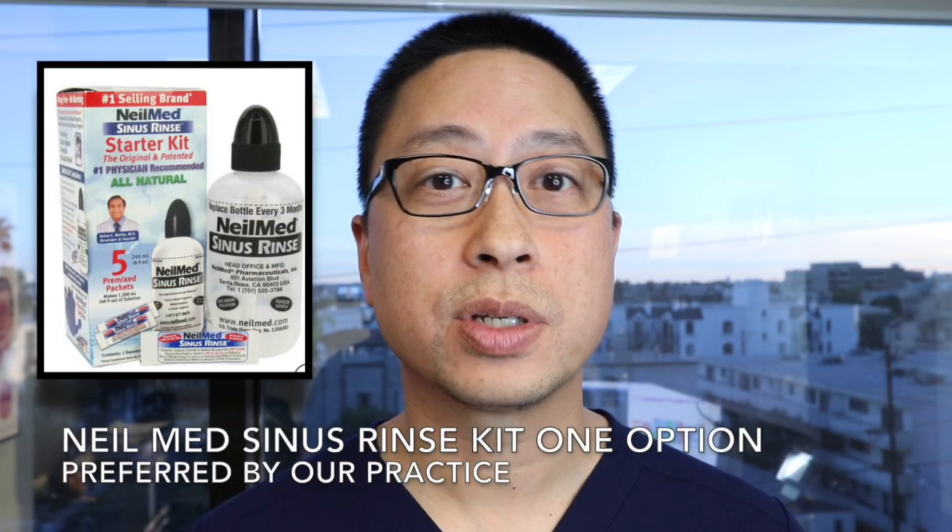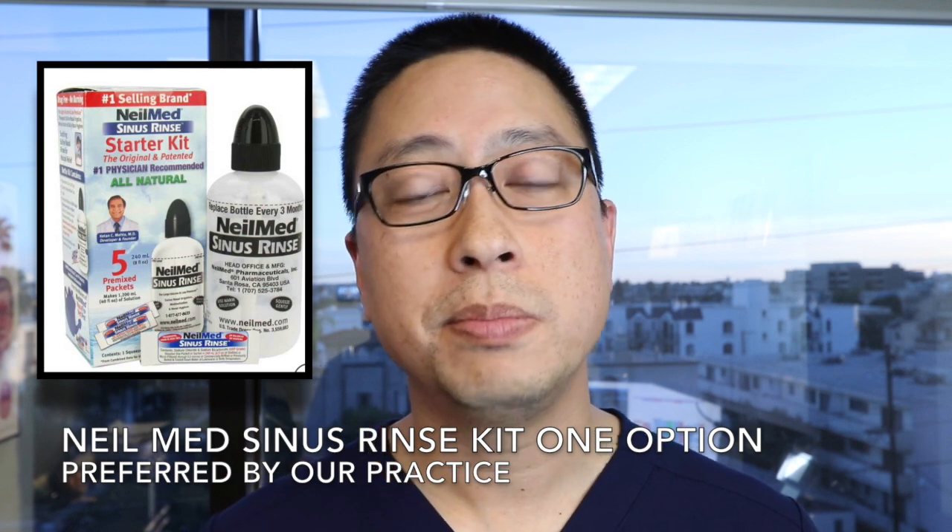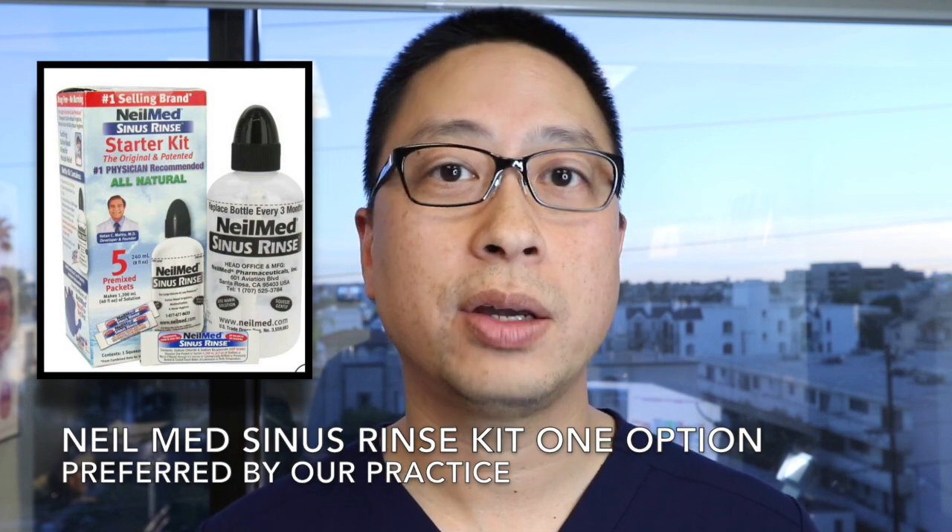My colleague Dr. Arthur Wu is a rhinologist or sinus specialist, and he's going to tell you how to mix things together and demonstrate how to irrigate your nose.